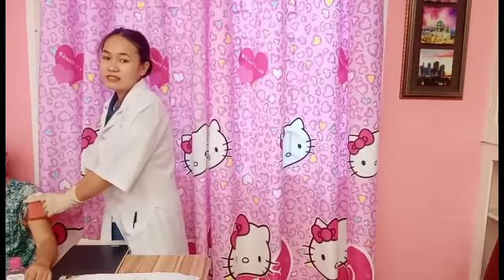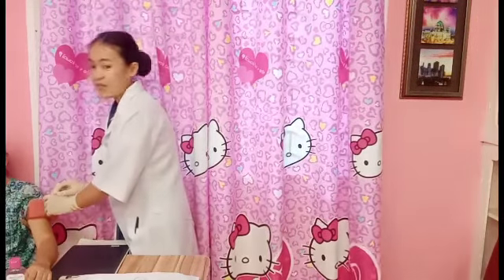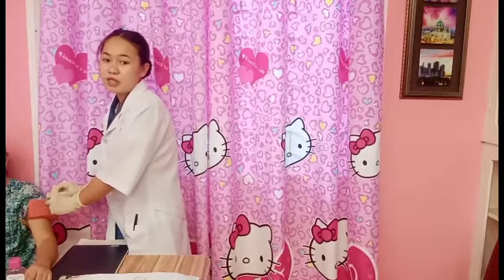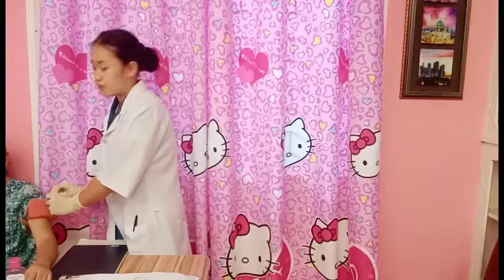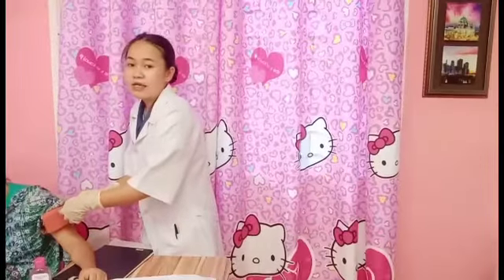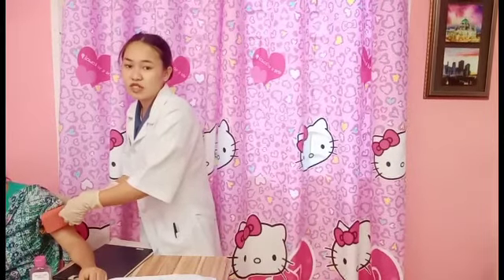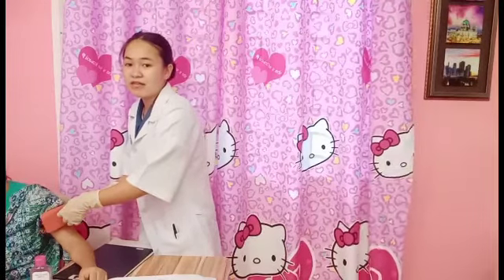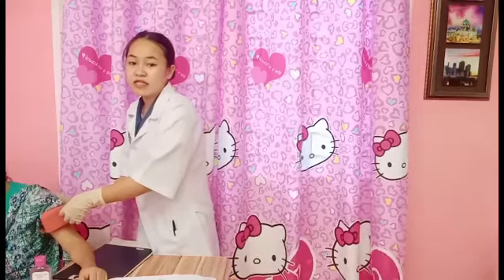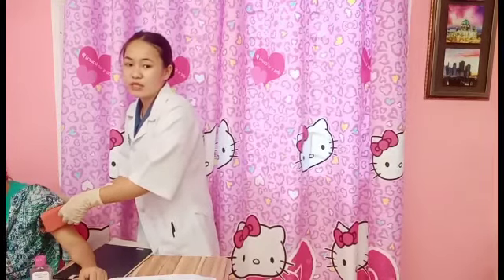So, when the needle is inserted, move your non-dominant hand to the end of the plunger. And then, inject the medication by holding the syringe steady and depressing the plunger with slow and even pressure. The needle should remain embedded within the skin for 5 seconds after complete depression of the plunger to ensure complete delivery of the dose. And then, remove the needle.